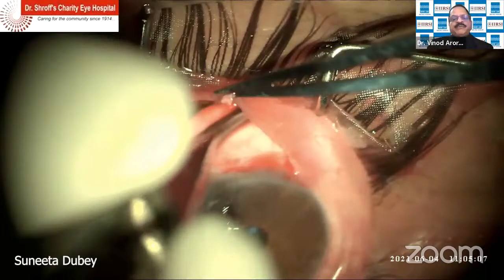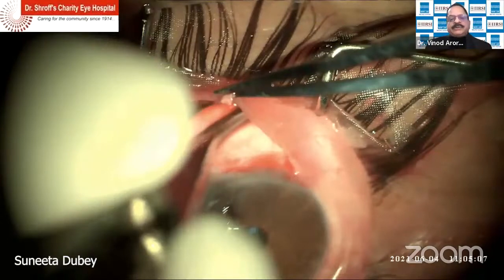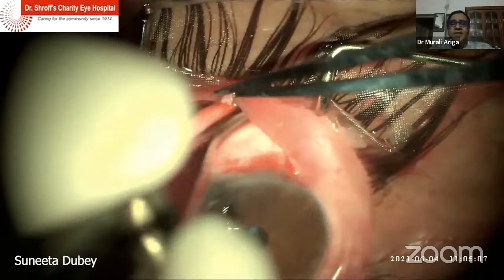And it's going to decide where the bleb is going to form. Yes. So how are we going to undermine the conjunctiva, which area are we especially looking for? Are we going up or going sideways? What is your strategy for that? For making a good bleb, there should definitely be a good dissection, but not a very harsh dissection. It should be a gentle dissection. And I usually dissect both conjunctiva and Tenon's together. I don't do separate dissection.